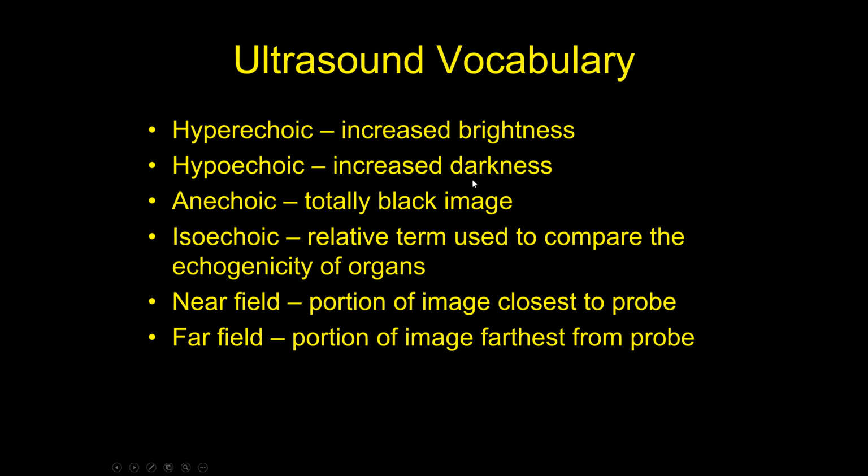If that nodule shows up darker on ultrasound than the surrounding tissue, you would describe that nodule as being hypoechoic, so not enough echoes or not enough sound. So it's hypoechoic.